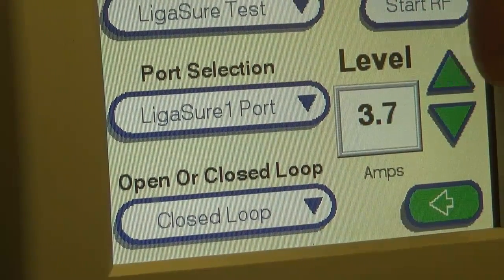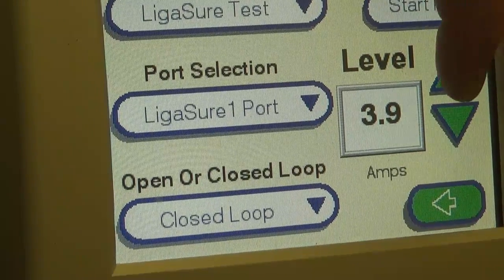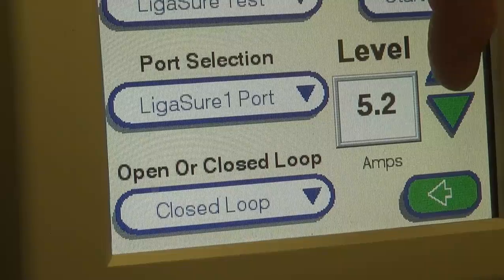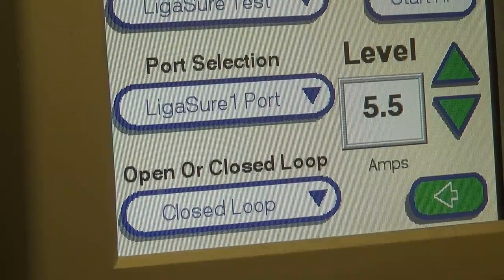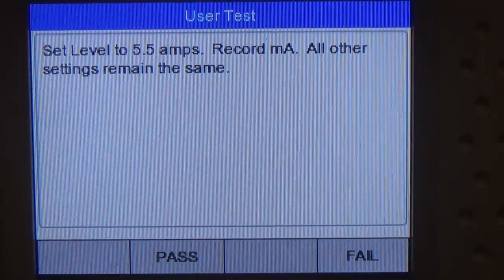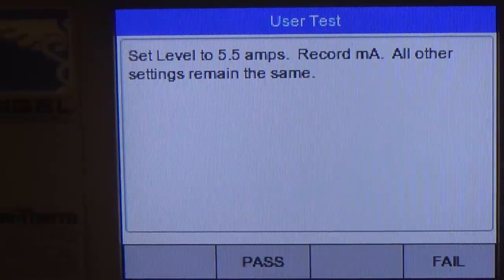Again, another reason I really like to use the shielded banana plugs. 5.5 amps will burn your fingers. In fact, it'll leave a small little hole in your finger if you accidentally touch it. And that's not hypothetical. It's happened to me.